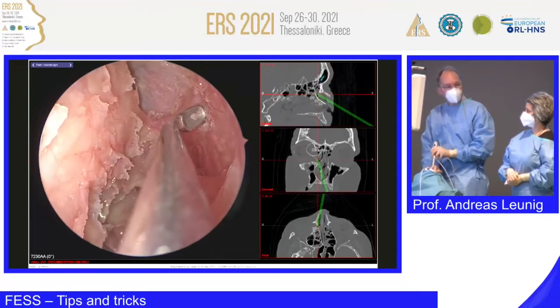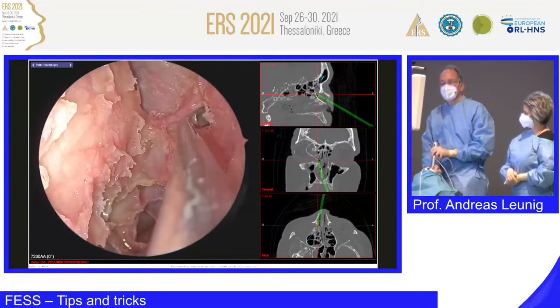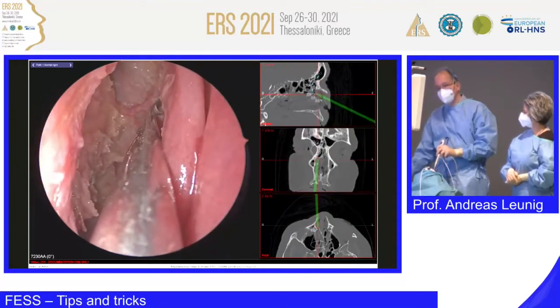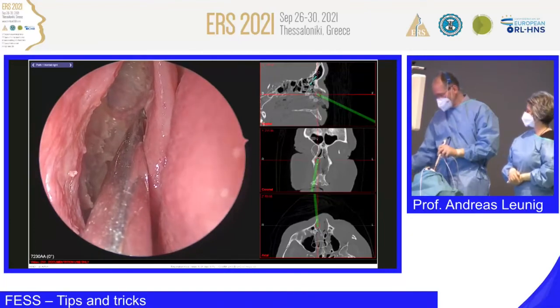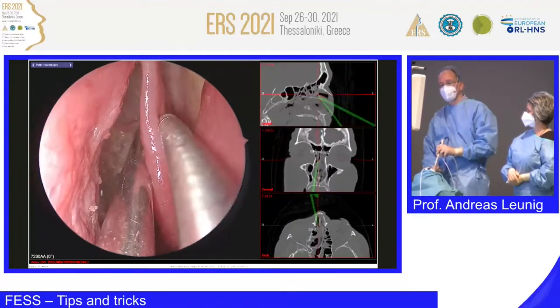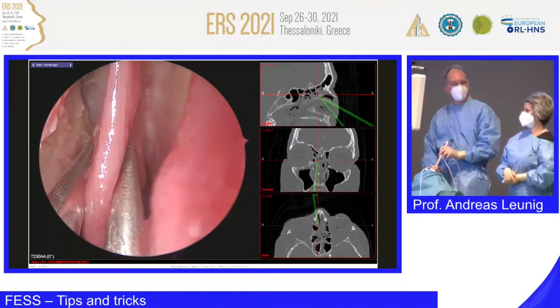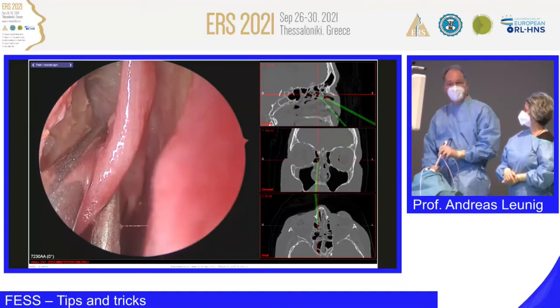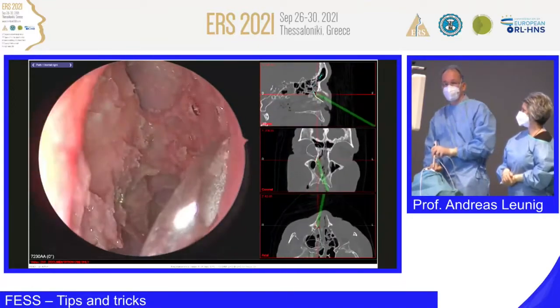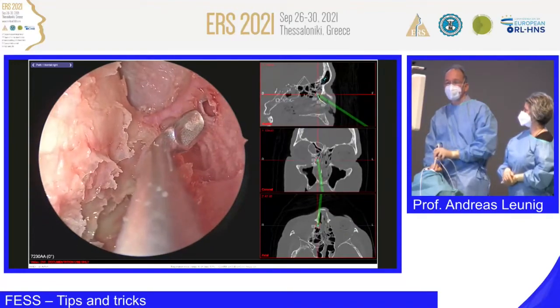This is a knot, okay, please don't, but I have to show it. We will see. So when we go in here, now let's go back, or let's see if we have a pointer. I leave my instrument in, hopefully it stays, and I try to come endonasally, hopefully it's working, to show you if I'm right or not. Oh, can you see? I'm higher than the olfactory cleft, and I'm intracranial, and this is what you definitely should avoid. Don't do it. And if this happens, of course, you have to deal with this. Can you see it here? Oh, we have a CSF leak. Can you see it's running?